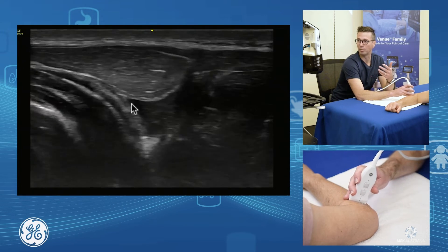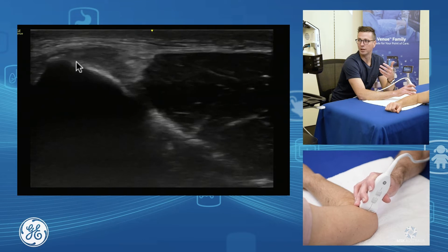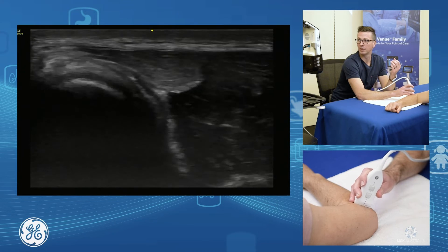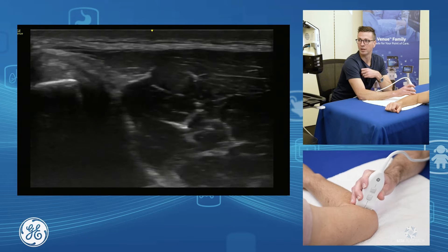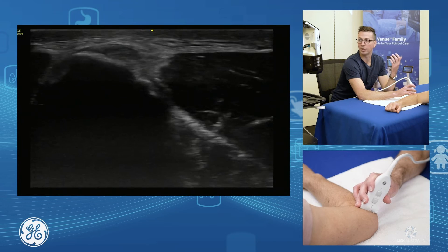As I bring my probe back up proximally, we see our ECRB fibres coalesce up to form the main part of our common extensor. So that's ECRB in short axis — back towards the muscle, musculotendinous junction, and up towards the tendon enthesis. Here's our short axis assessment of our common extensor.